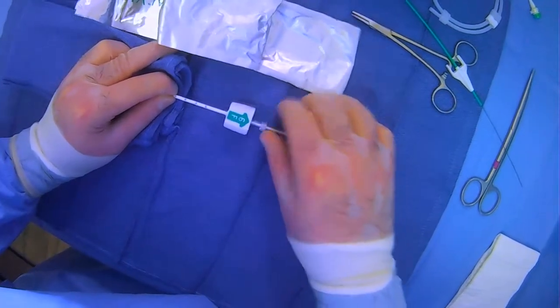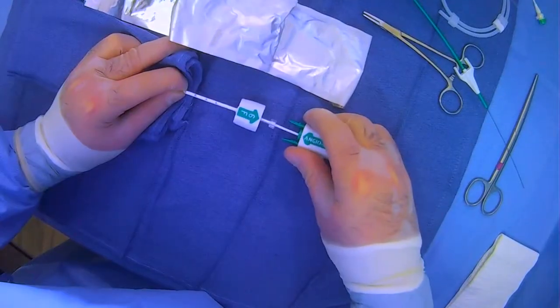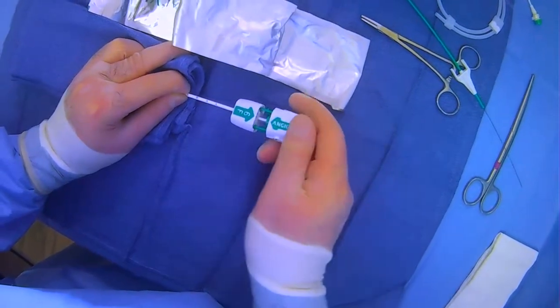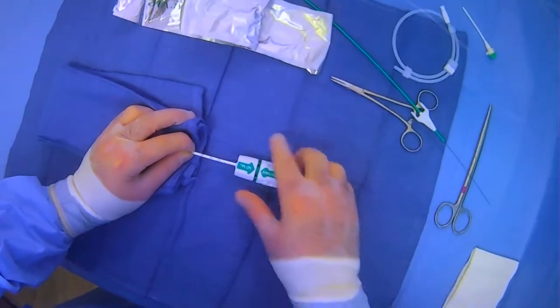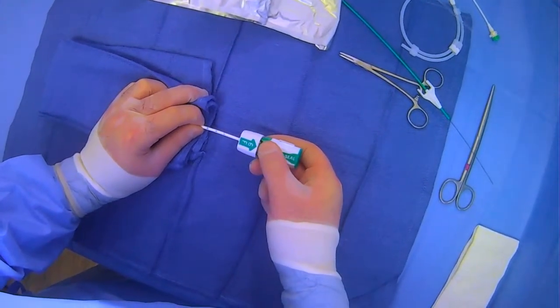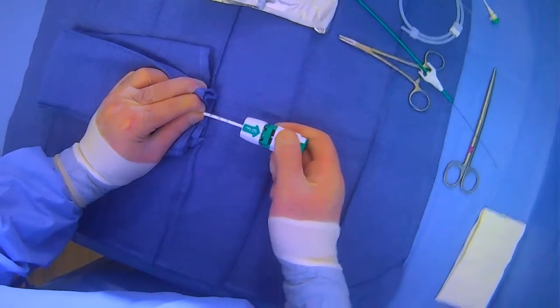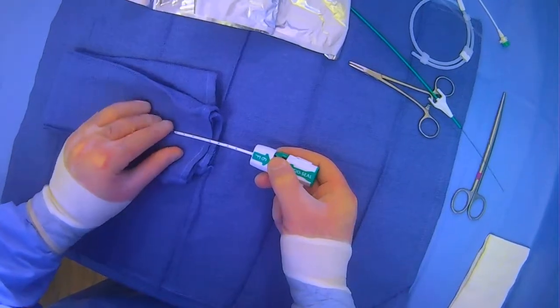Now we're going to push this together until we hear a click — that's our first click, which means that the anchor has been deployed. Then we pull back and click again, which means that the anchor has been locked.